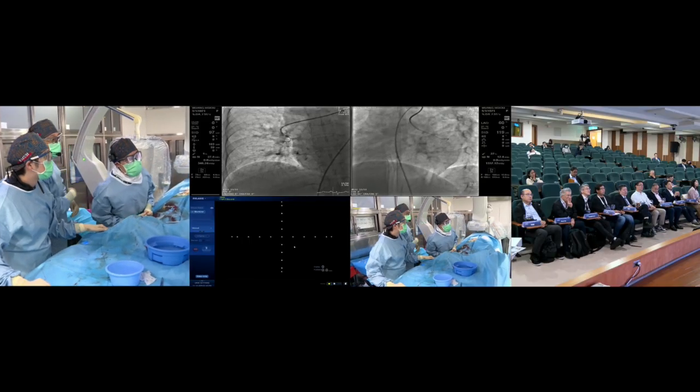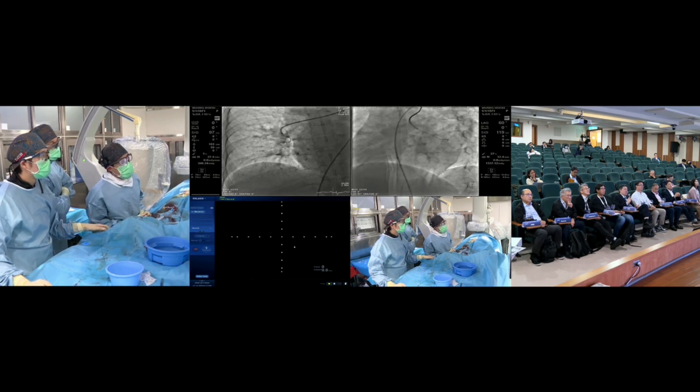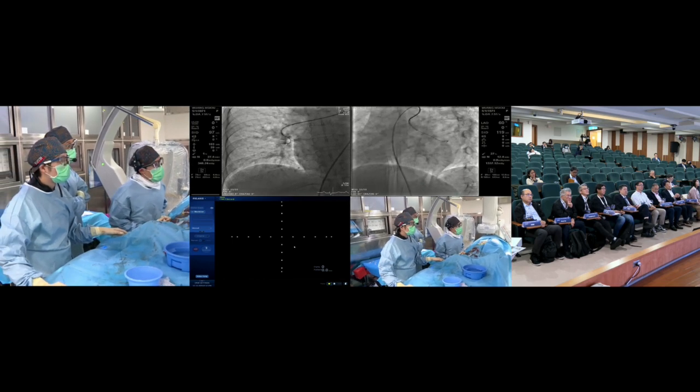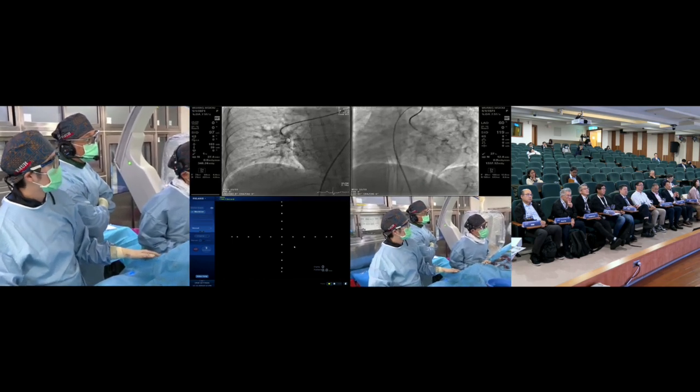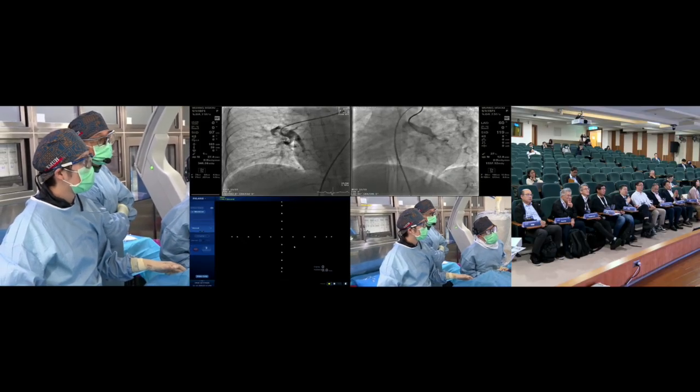Oh yeah, you can see on the pulmonary angiography there's a lot of thrombus in the. This is A6. A6. Yeah.